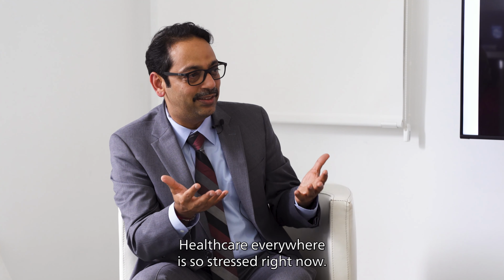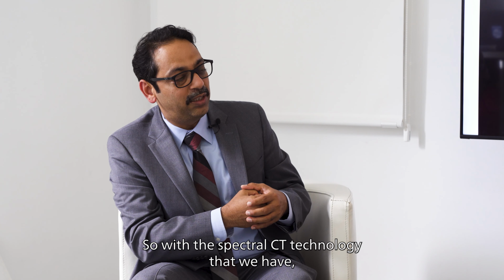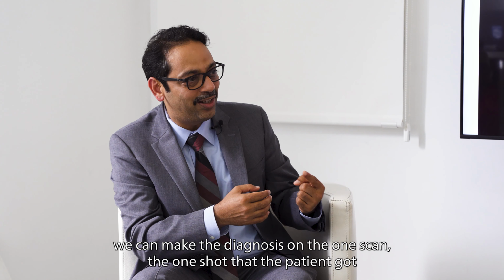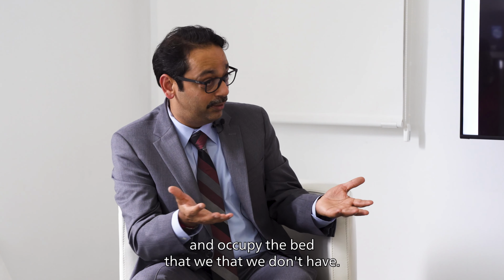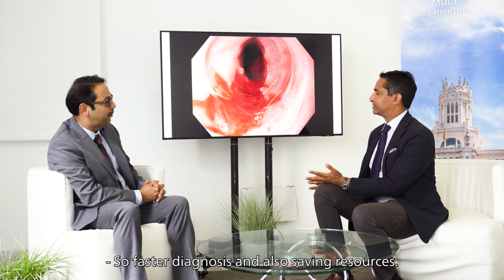Healthcare everywhere is so stressed right now. So with the spectral CT technology that we have, we can make the diagnosis on the one scan, the one shot that the patient got, and not have to bring the patient back and waste the time and occupy the bed that we don't have. So faster diagnosis, also saving resources.